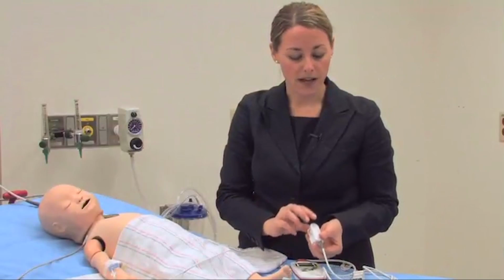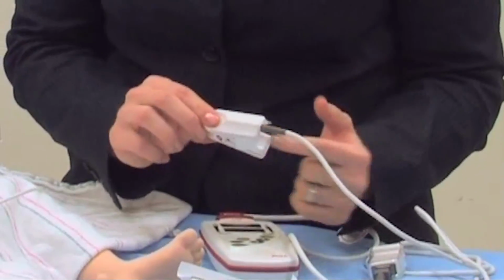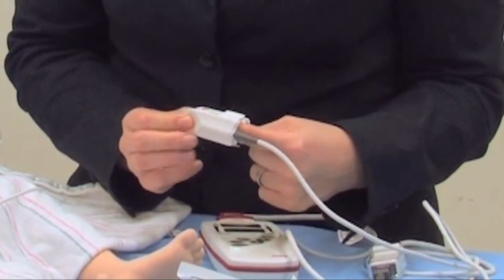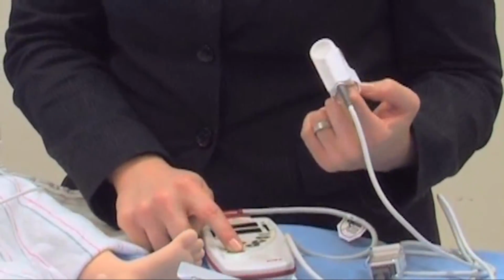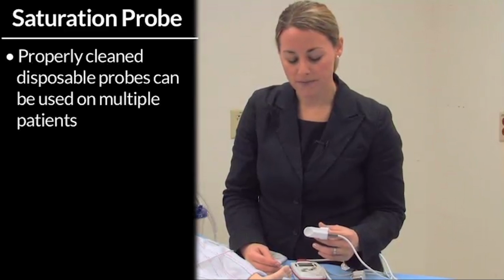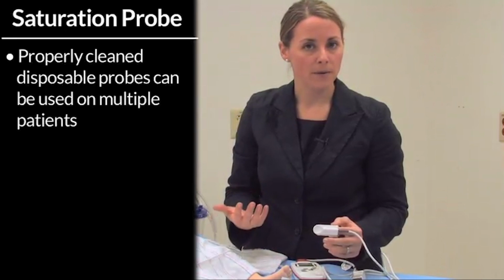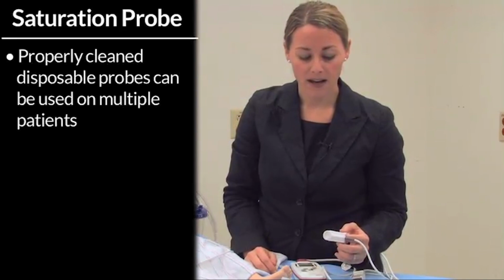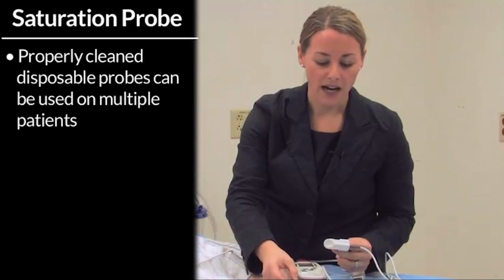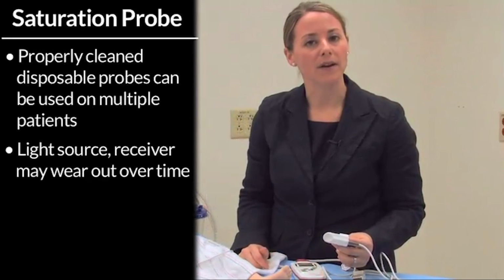Alternatively, you could use a reusable, this is a finger reusable probe. It's got a picture of a finger here, and it's meant for you to put your finger inside and allow this to close over the device. These, as long as they're cleaned, can be used on multiple patients. The disposable probes are meant to be used only on one patient, but in certain environments, you may need to reuse them, and as long as you clean them, they can sometimes be reused. It must be said that over time, the light source and the receiver may get worn out and may give you not very accurate readings over time.